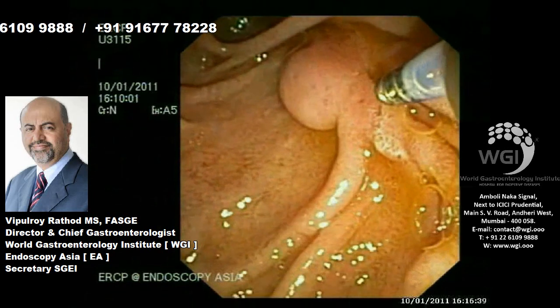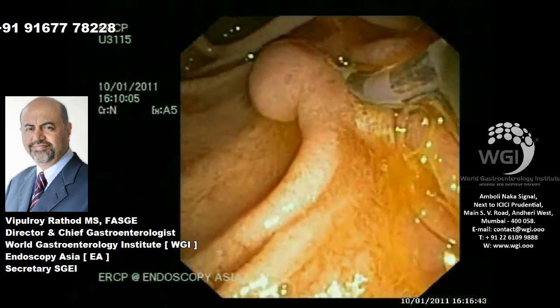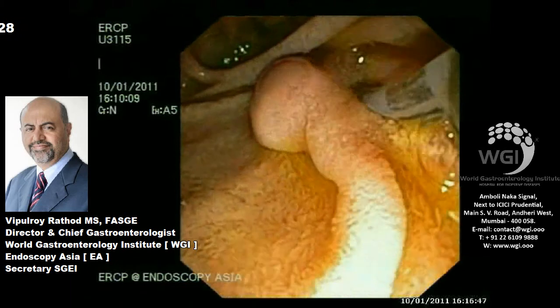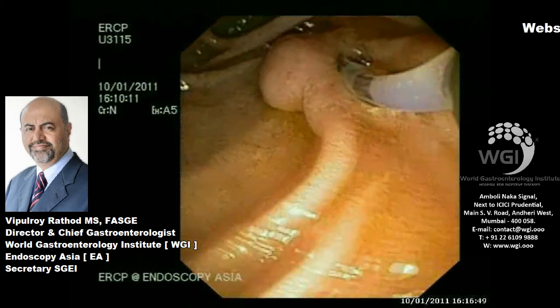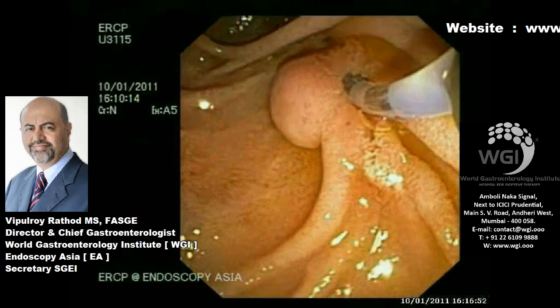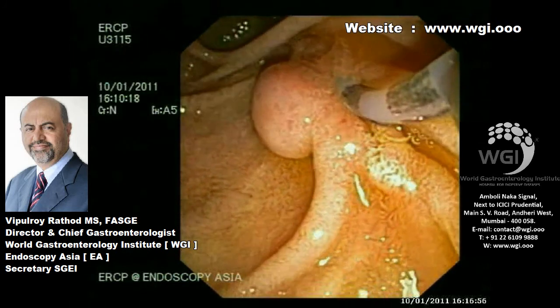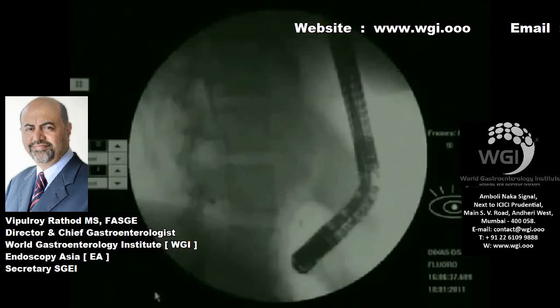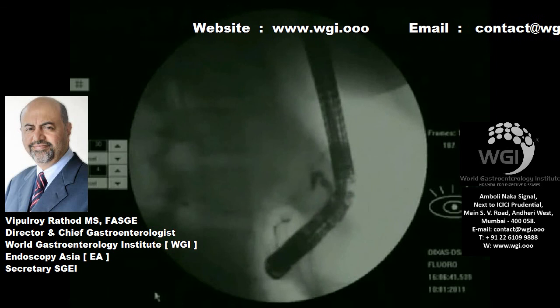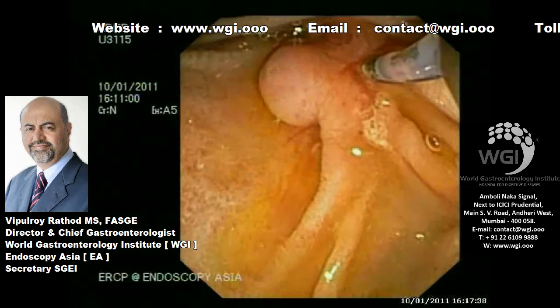We will try to cannulate the pancreatic duct through the major papilla. Once we are en face to the ampulla, we will cannulate the pancreatic duct and try to obtain a pancreatogram. We are able to see some amount of pancreatic duct with stricturing.